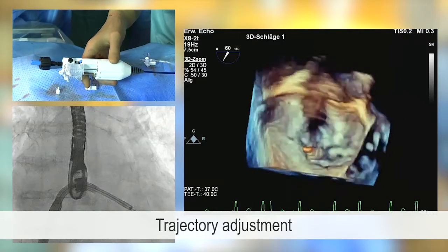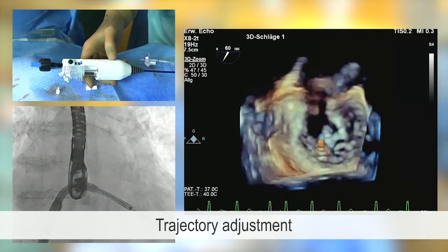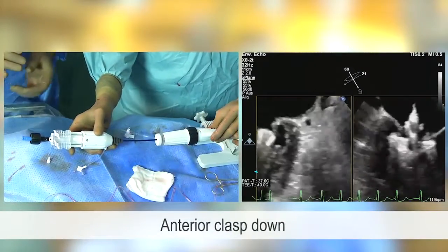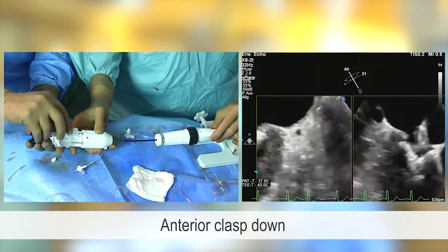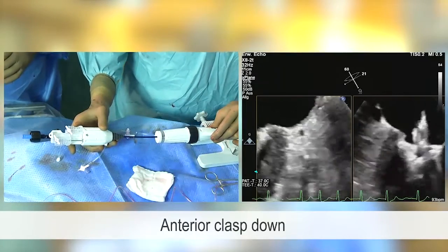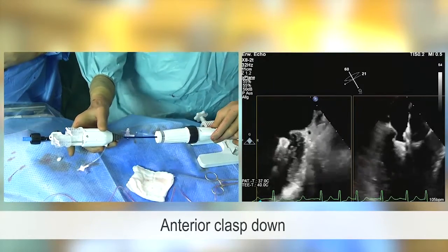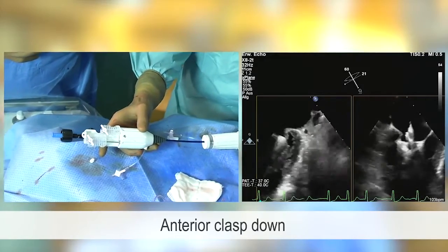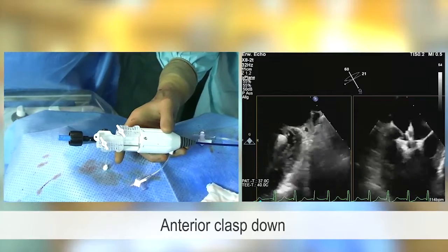We double check on 3D, and as you can see here now, we're now aiming for a clocking which is probably more 1 to 7 o'clock rather than 6 to 12, because we moved further out into the lateral part of the valve. What we also thought we should do now is we get the anterior leaflet on first, we put the clasp down, and then grasp the posterior leaflet after the anterior leaflet.